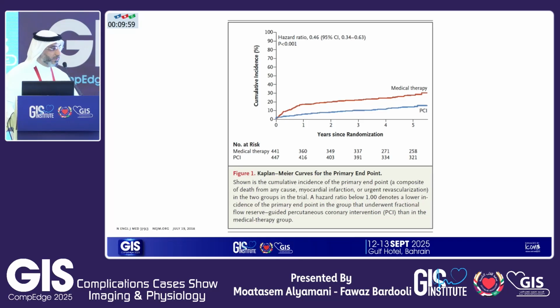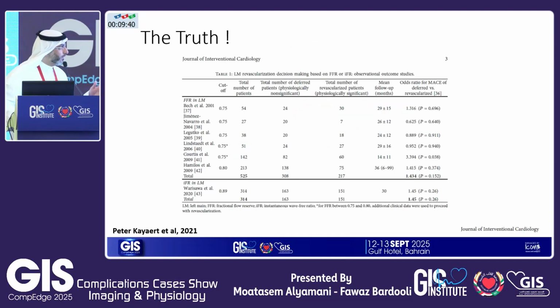And the Class 1A physiology comes from robust evidence that physiology guidance in stable disease is superior to medical therapy. So that's why we should use physiology, as you guys know from the FAME trials and all of that. Now, the shocking truth is that most of these large studies excluded left main disease from their patient population. And you can imagine why. It's really hard to say, okay, you have a positive FFR, I'm going to randomize you to medical therapy in the left main. So that's a hard thing to do.